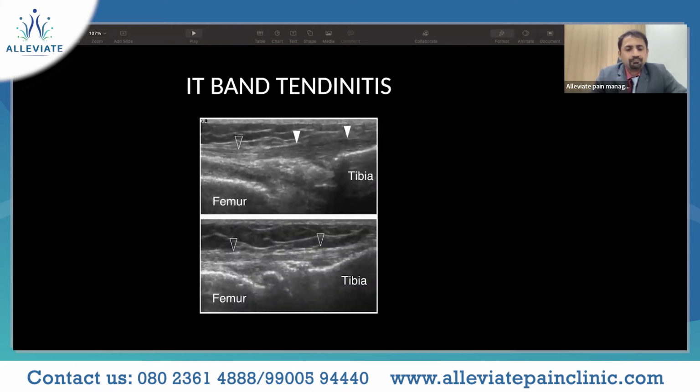IT band, again. Of what all discussions have happened till now, you have to realize one thing, that when a patient presents to you at any age, it is not only arthritis which could cause the pain. So giving an intra-articular injection may not suffice. It's always better to do a complete scan wherein you can pick up the medial, lateral, the superior area, come down below the patella, and the infrapatellar and suprapatellar areas. All these assessments are very important.